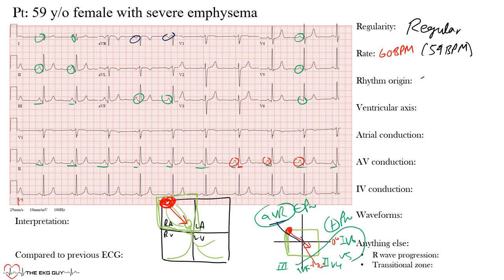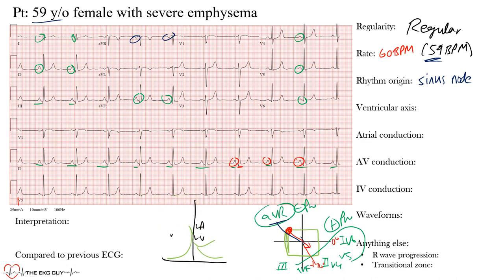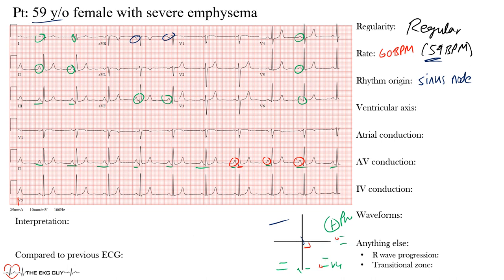In fact, we do have a rhythm originating from the sinus node — sinus rhythm — at a rate of 59 beats per minute. Moving on to the ventricular axis: there is also a QRS axis, or ventricular axis. The ST segment and T-wave also have axes, but here we'll focus on the QRS complex.